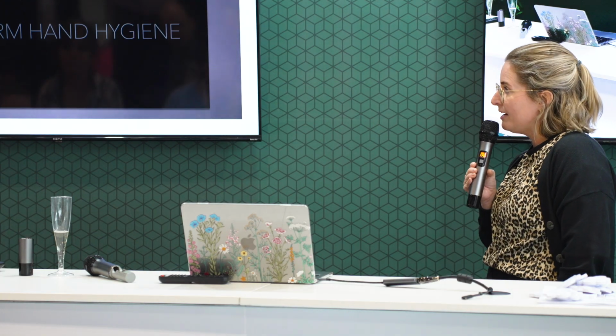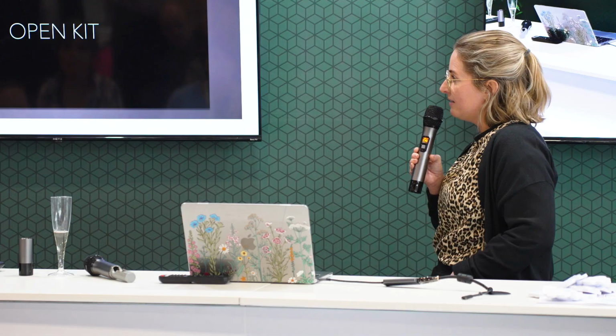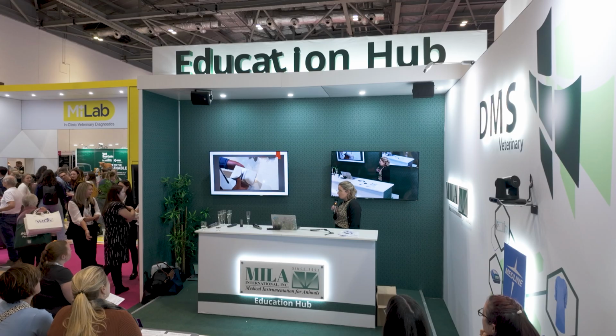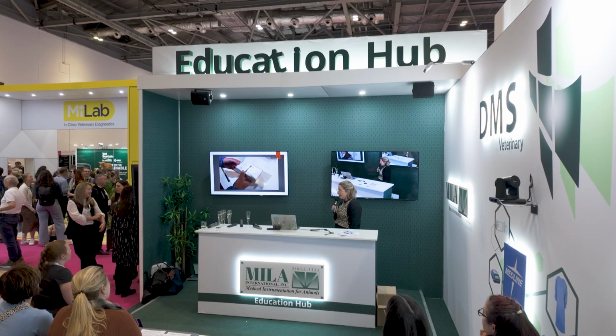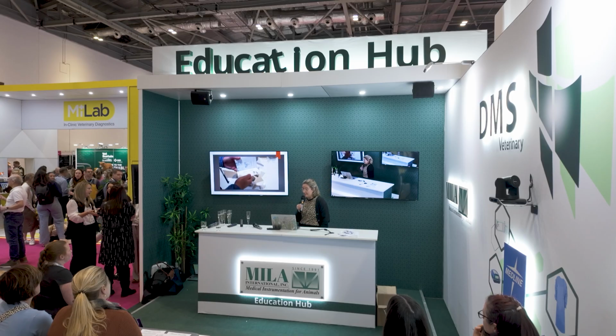Now, to place them, as we said, we would want to carry out that patient preparation. So clip that hair away, give that a wipe with an alcohol swab. And then as you'll see, you can open up the kit that you're using and take out all of the bits inside. And so this is one that we placed in a home setting.